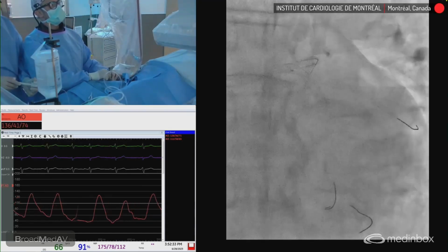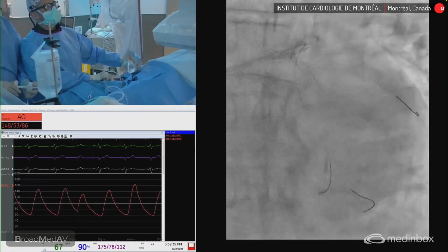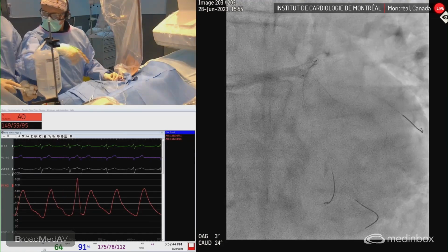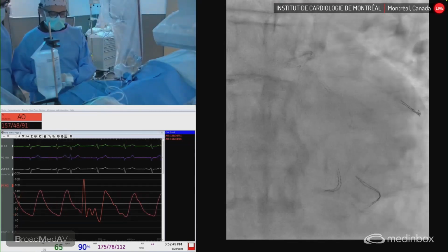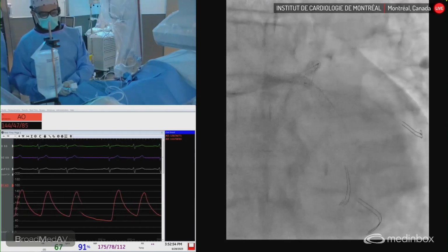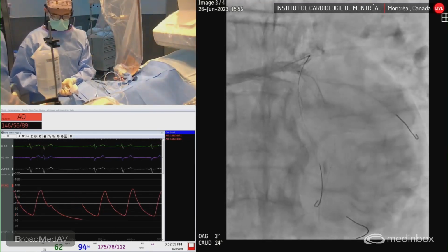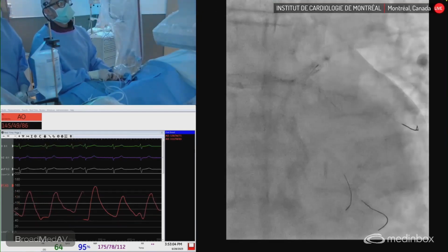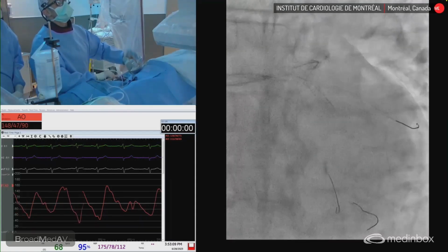12. Wait. Interesting to see that we're all undersized, as you could see flow in the LAD. Ouais. So that means 14. Really we need to go bigger in the left main. 14. Montre-moi. Okay, what do you need? Just going to pot with the, I'm going to go 20 atmospheres, really high, with the stent balloon, just so that it makes it easier for us to re-engage after. I'm going to pull on the balloon. The guide should go in. That's good. That's nice.